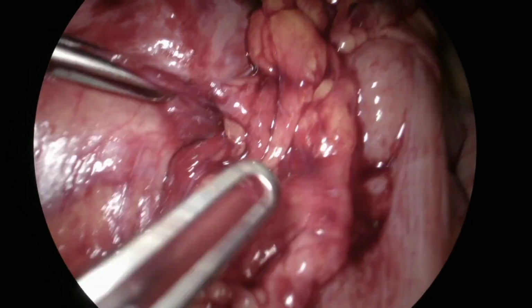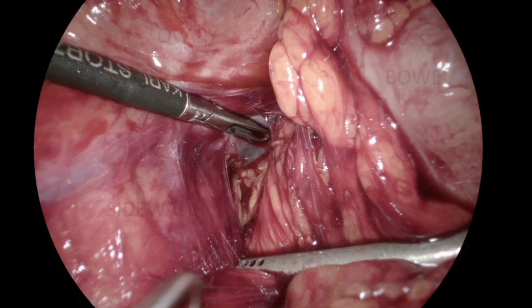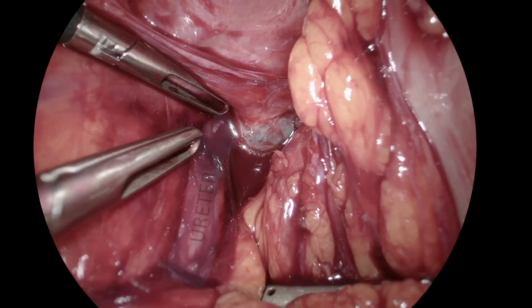Having identified the ovary, we then freed the bowel inferiorly using a combination of sharp and blunt dissection. This revealed the pelvic sidewall. We now begin step 2, enter the retroperitoneum and perform ureteral lysis. The ureter was identified through the parietal peritoneum just below the pelvic brim, where it enters the pelvis by crossing anterior to the bifurcation of the common iliac vessels and courses caudally along the medial leaf of the broad ligament.